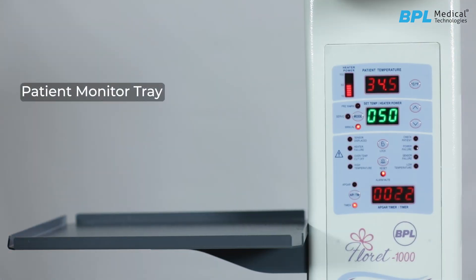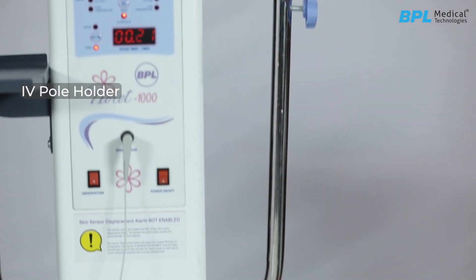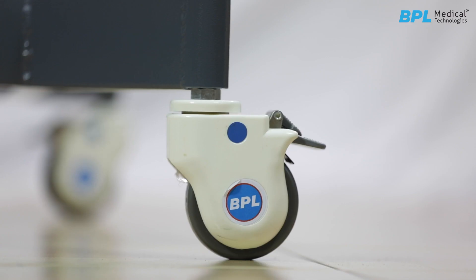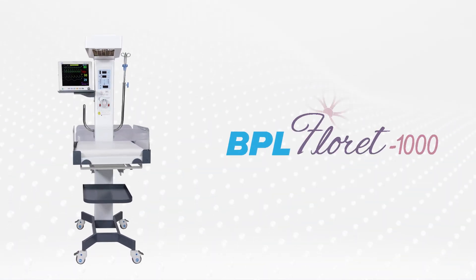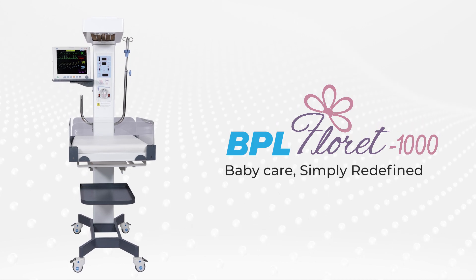The Floret 1000 series comes with a patient monitor tray and an IV pole holder. It has four caster wheels along with brakes. BPL Floret 1000 infant radiant warmer — baby care, simply redefined.